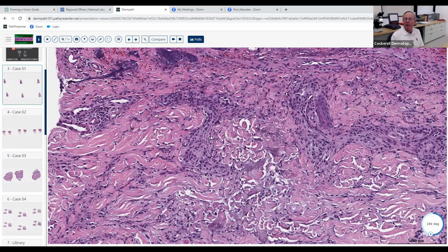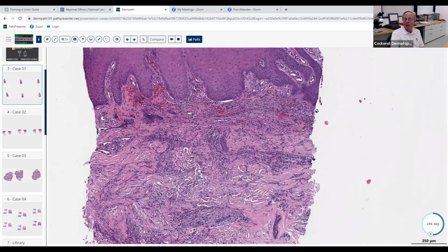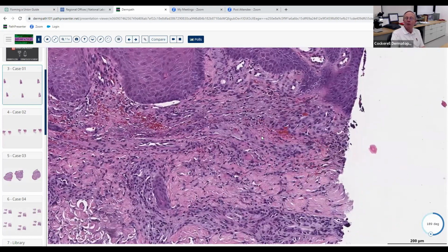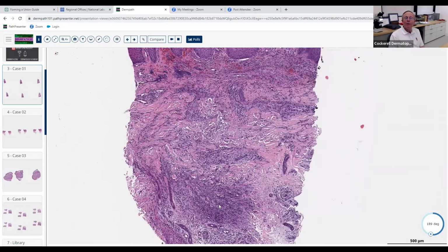So whenever you see this pattern, you need to step back and ask, does the patient possibly have some underlying connective tissue disease? It's just another thing in that differential diagnosis of palisaded granulomatous dermatitis. So if you see that pattern and then you see neutrophils, then you say it's palisaded neutrophilic granulomatous dermatitis. It's associated with connective tissue diseases, and you need to go back and work the patient up, see if they've got RA or lupus or some other connective tissue disease.